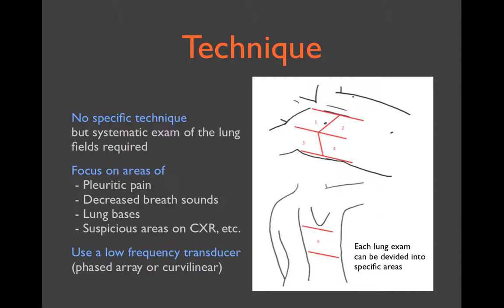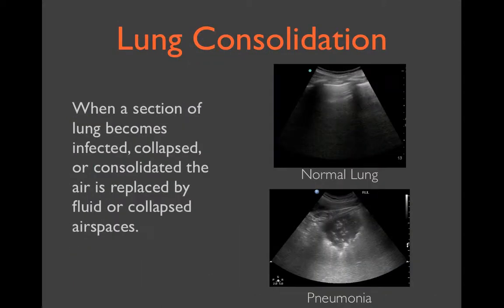As we know, normal healthy lung is mostly air and produces a vague foggy appearance on the ultrasound without any actual lung tissue image. However, when air is removed from a section of lung and the air spaces are either collapsed or filled with fluid, the deaerated lung parenchyma produces a tissue image that is easily identifiable with ultrasound.